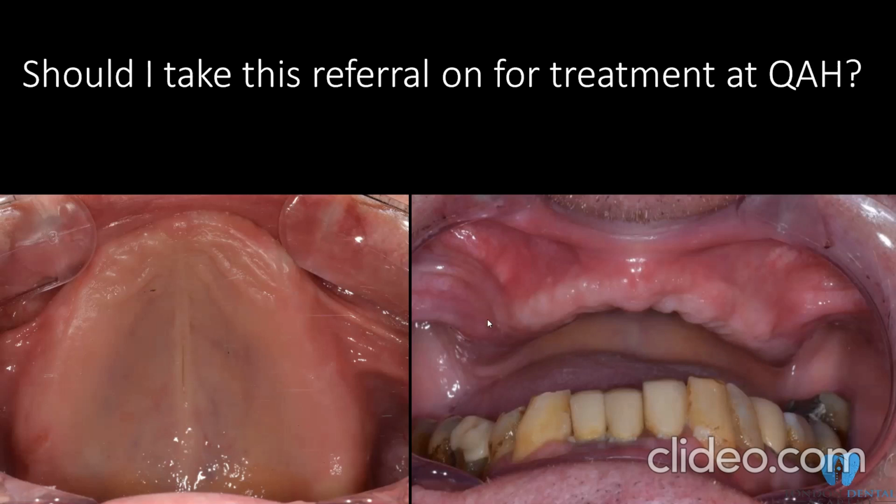Although it's a nice ridge, as you can see, a very nice height, covered with healthy keratinized mucosa, very stable, with no very big frenum present on the left or the right-hand side, I can see undercuts, especially on the left and right tuberosities. That could add to the difficulties. Sometimes you need to be very careful, guys, when it comes to such cases. Don't be surprised if you get a big ridge and poorly retentive dentures.